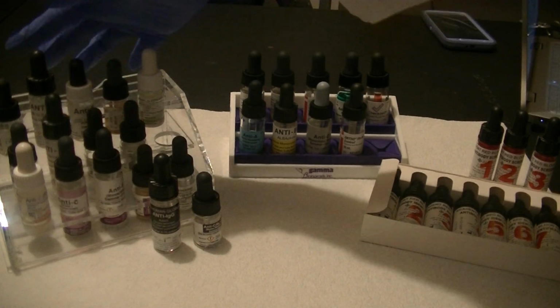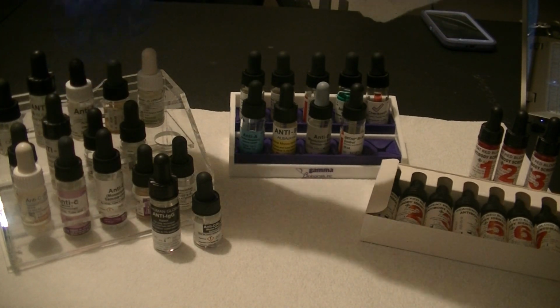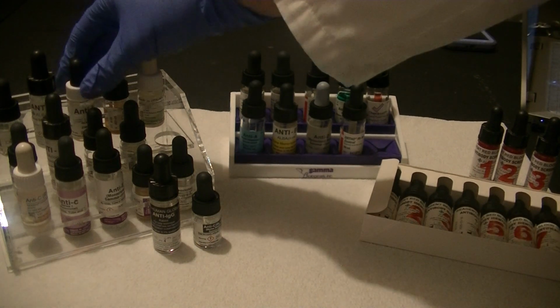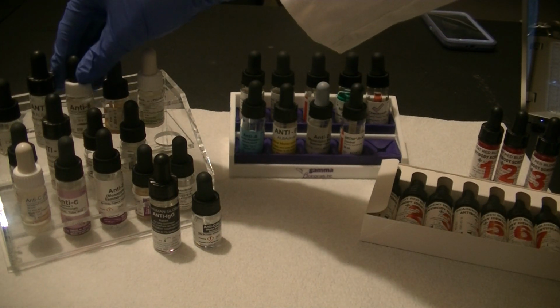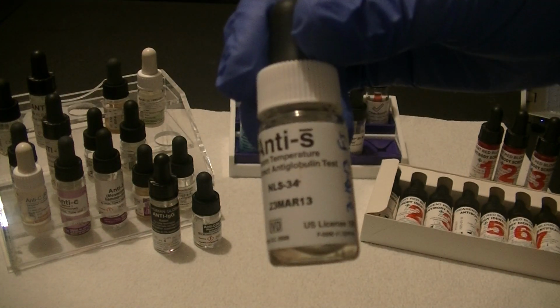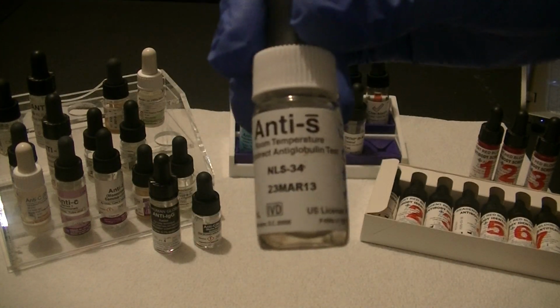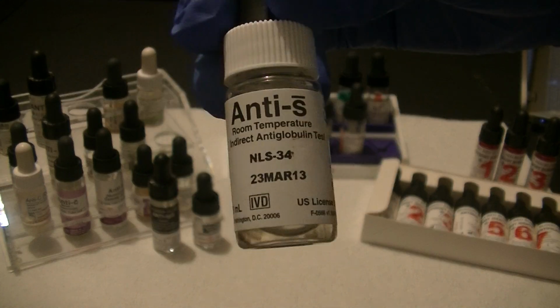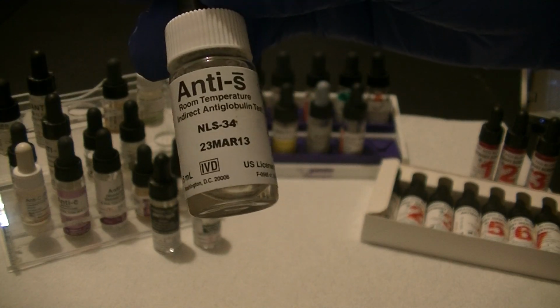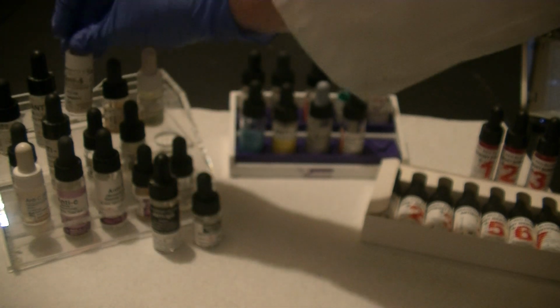So for that reason, I have this rack on this side that has all kinds of other anti-sera. There are antibodies that can be on a person's blood cell that are known as little s. The little s has a line over it, and that shows us that it's a lowercase s, and this bottle has in it antibodies that will bind to the antigen little s.